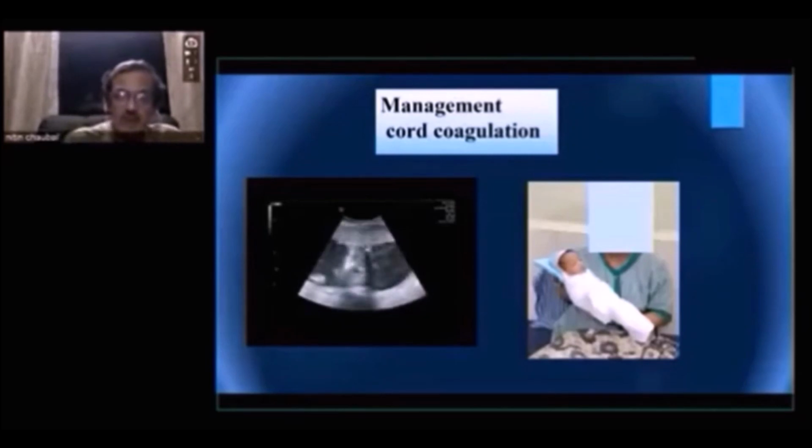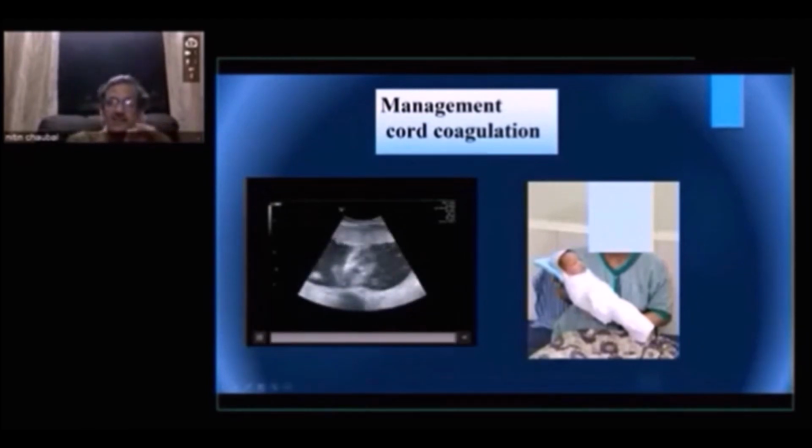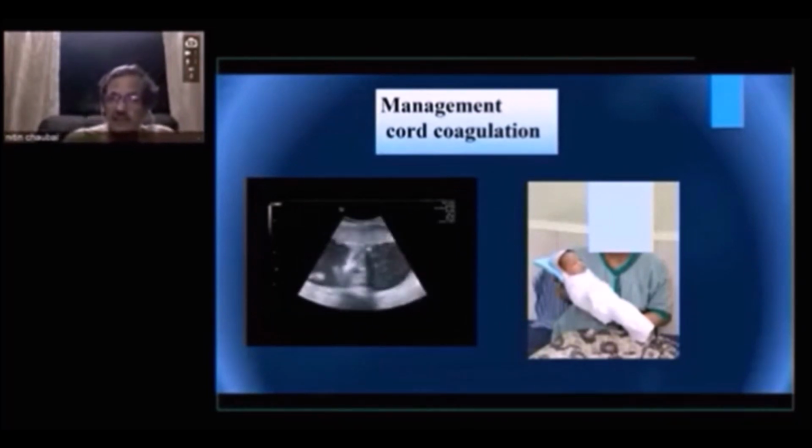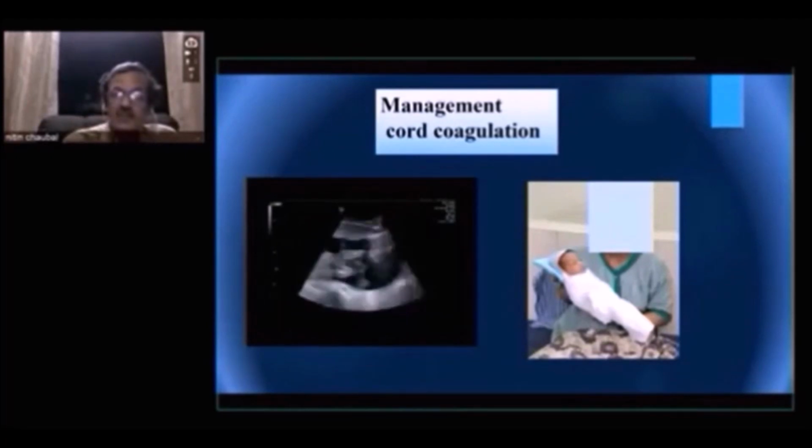So that's a bipolar cautery cord coagulation. In this particular case, this was one of our initial cases. Prashant had come and helped us in this case. So bipolar cord coagulation is relatively a very good technique for selective reduction in an sFGR. However, the technique is maybe slightly difficult, especially holding the cord. Though it looks very easy, very often it's not easy because the cord slips. But the cord coagulation happens very fast.